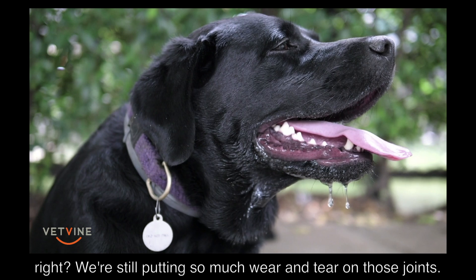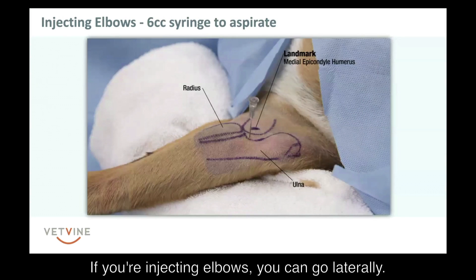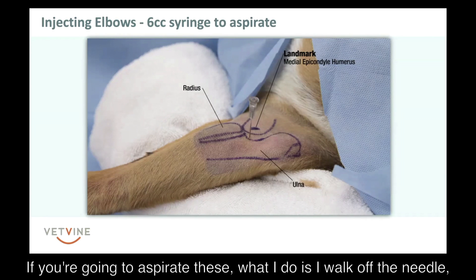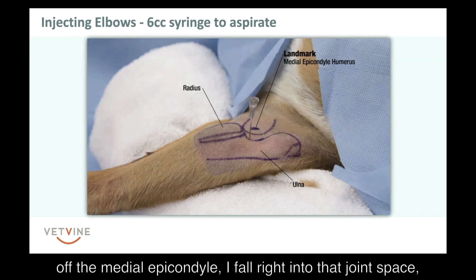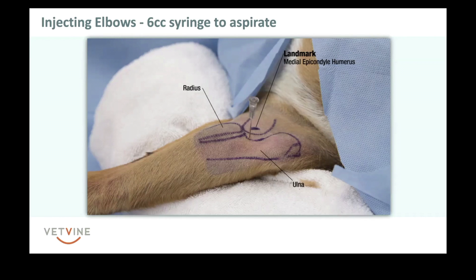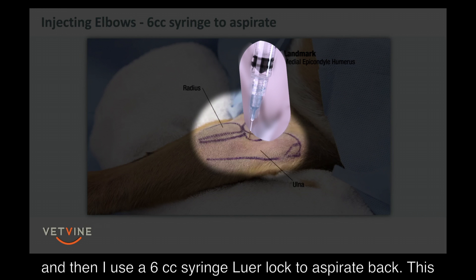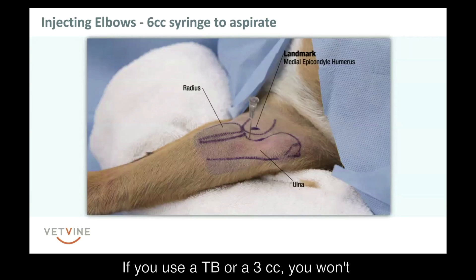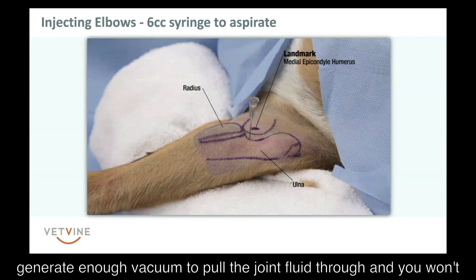If you're injecting elbows, you can go laterally — I prefer to go medially, just where I was trained. If you're going to aspirate, what I do is I walk the needle off the medial epicondyle and fall right into that joint space. Then I use a 6 cc luer lock syringe to aspirate back. This gives me the right amount of vacuum pressure on that viscous joint fluid. If you use a TB or a 3 cc, you won't generate enough vacuum to pull the joint fluid through.